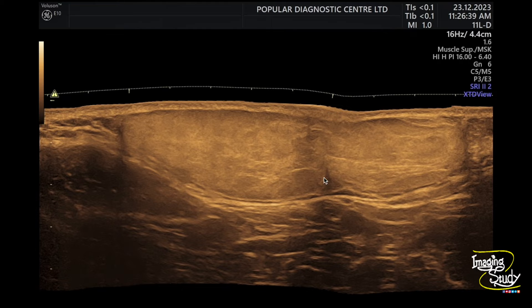Here we have compressed during the scan and you can see the slight compression. Lipoma is a compressible mass, like subcutaneous fat.